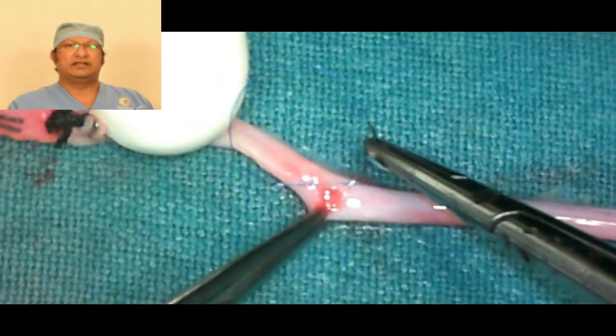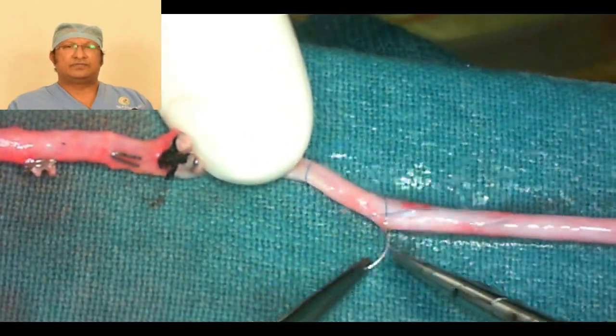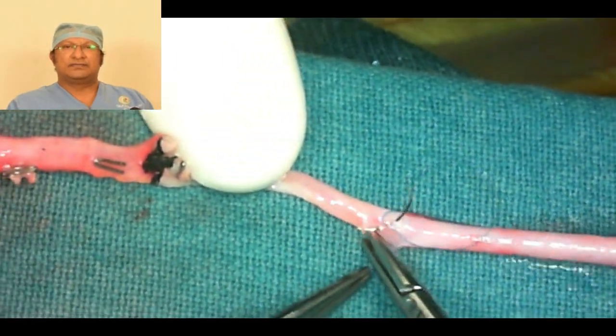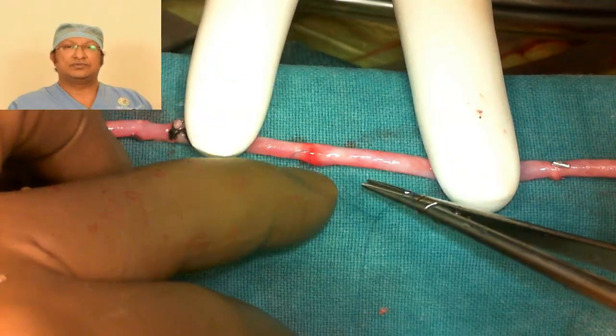These small holes will definitely bleed under arterial pressure. Handle them with monofilament prolene, size 7-0. Make sure you take only the adventitia and close the hole in such a way that you are not obstructing or narrowing the lumen of the vein.